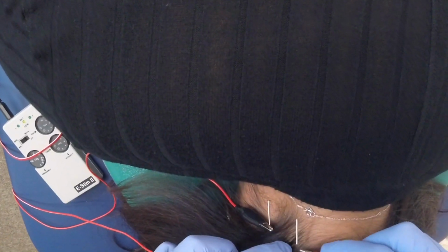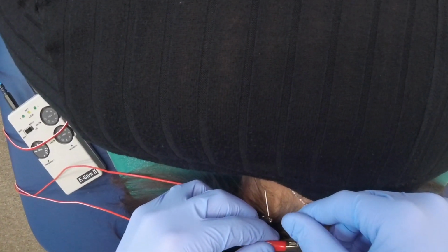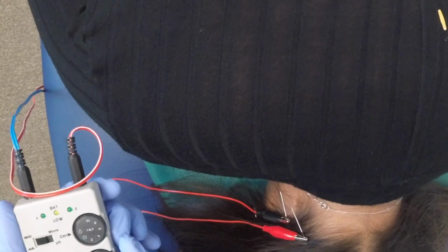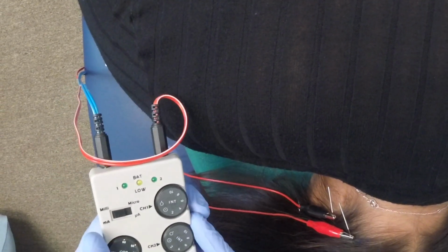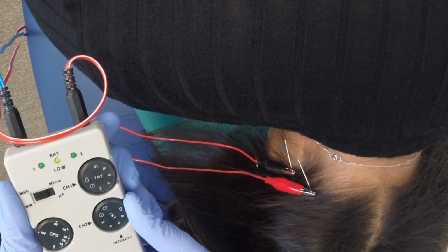So that's why we like to use that to help really maximize the dry needling instead of just doing the needling itself. The electrical stimulation is always to the patient's comfort, and we typically will try and go for about 5 to 10 minutes, or longer sometimes if patients can tolerate that, and a lot of times they will ask to go longer because it does feel good and they see those good results.